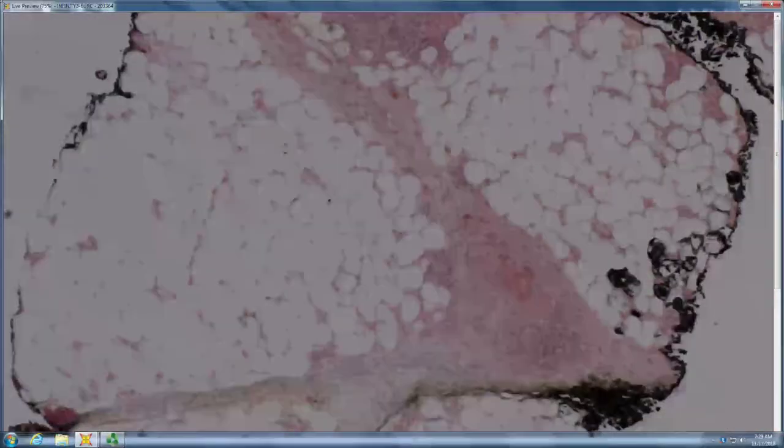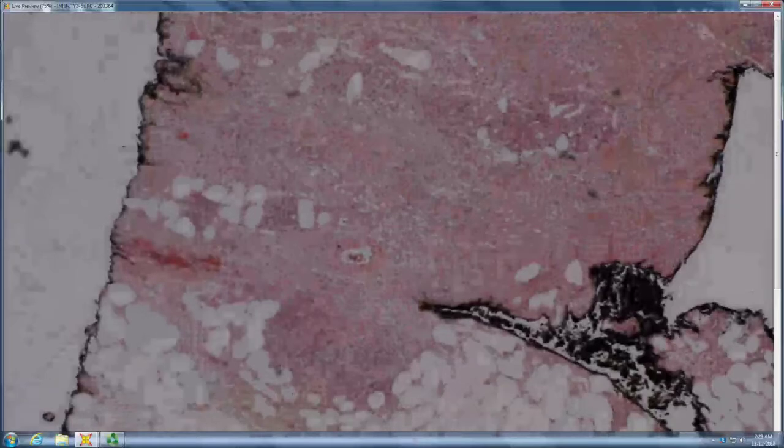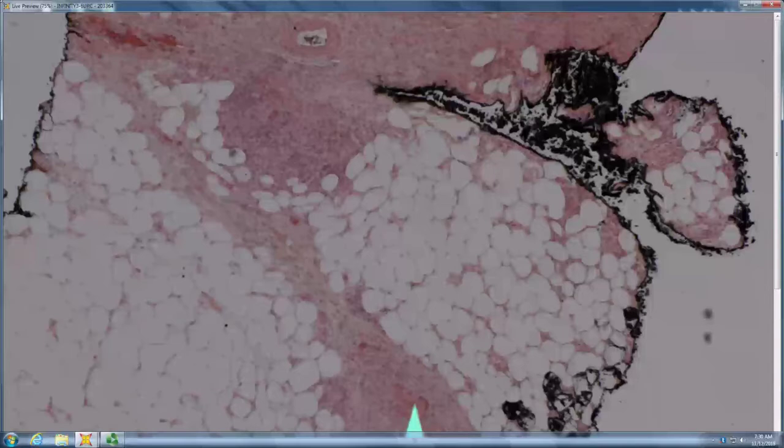Looks like you got some inflammation, superficial fat right in there. Yep. In the deep dermis. Trying to decide if it's around the vessel or anything. So not so much around the vessel. What kind of inflammation? Granulomatous. Definitely granulomatous in the septum.